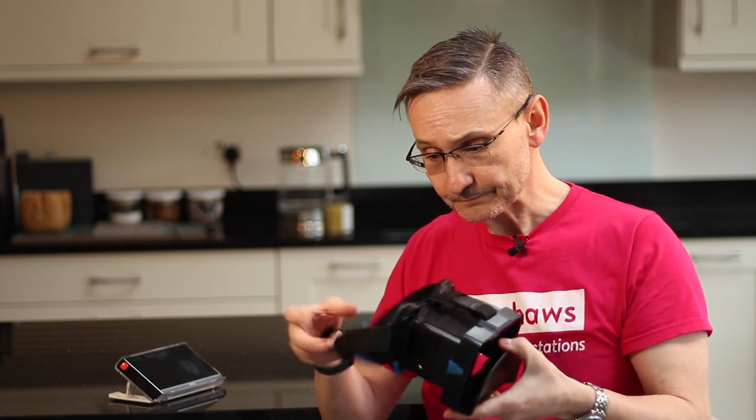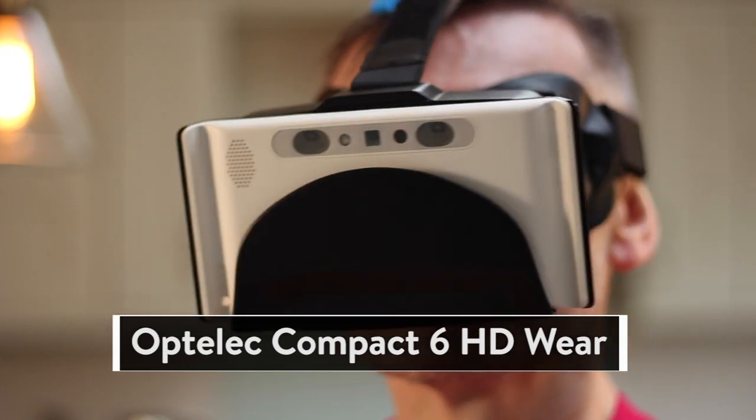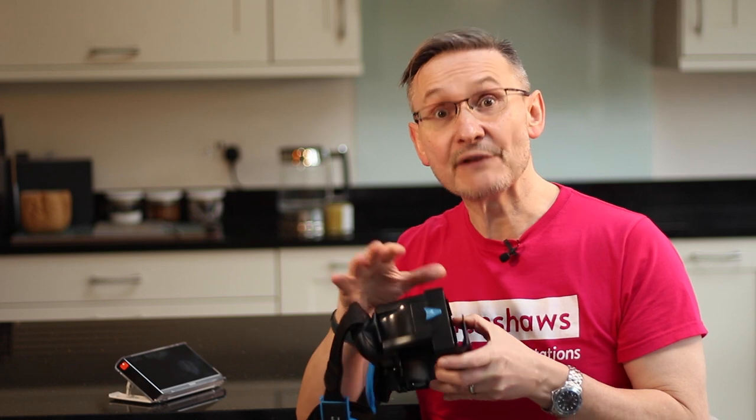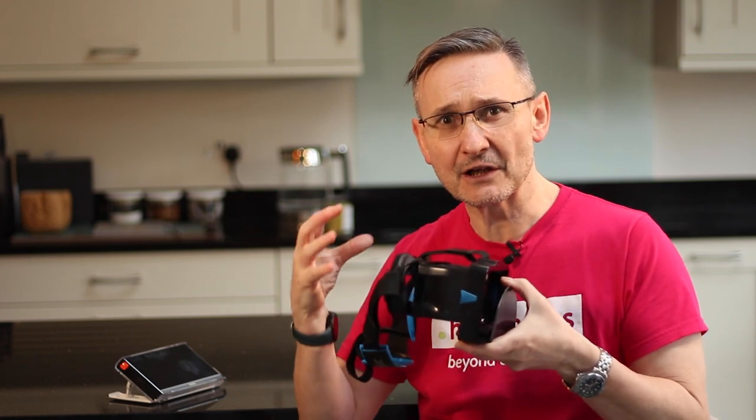Optelec have created an additional piece of kit which is basically headwear, allowing you to use the HD6 hands-free. You insert the HD into this kind of visor and put it on your head. It allows you to go hands-free for everyday tasks like reading, writing, watching TV, or possibly even cooking. They do say it's not for mobility. It can limit your peripheral vision, but they've thought about that — you can actually remove the side panels on each side so your peripheral vision isn't limited and it doesn't give you that fully enclosed feeling.